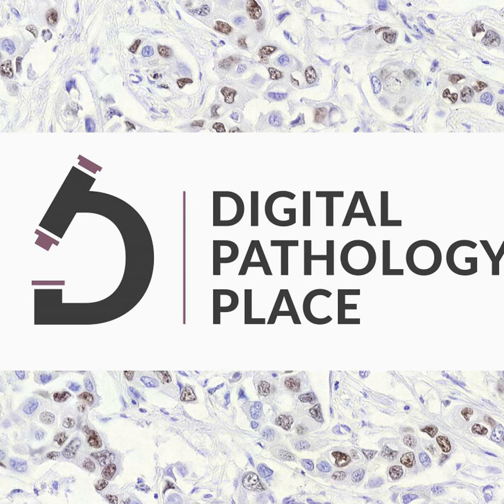This component moves the slides in 2 dimensions, X and Y axis, under the microscope objective. This allows different areas of the slide to be imaged sequentially. 4. Microscope objective lenses. This functions as the eye of the scanner, magnifying the sample on the slide to a level that can be captured digitally. Different scanners may use different types or numbers of objectives depending on the level of detail and speed required.